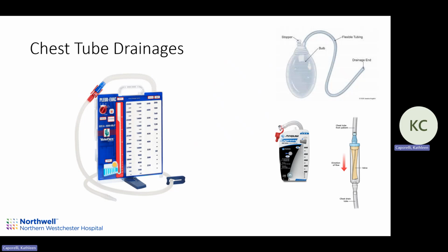One is something called the mini atrium. It's basically this Pleurovac in a smaller system. Do we have mini atriums here? Okay. Well, that's an option for patients who are stuck in the hospital and they still have an air leak, but they can tolerate it on water seal.